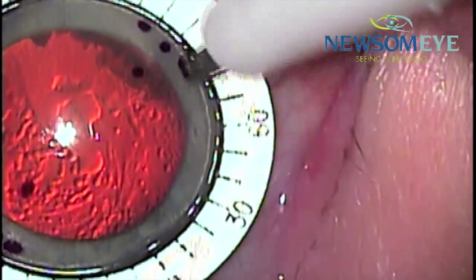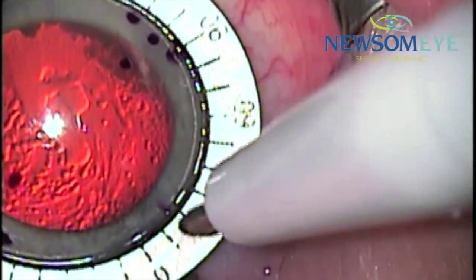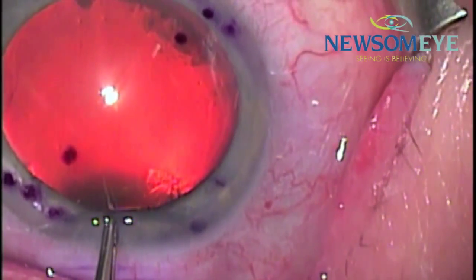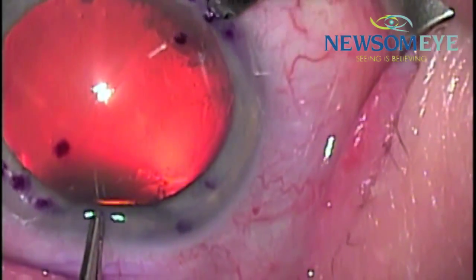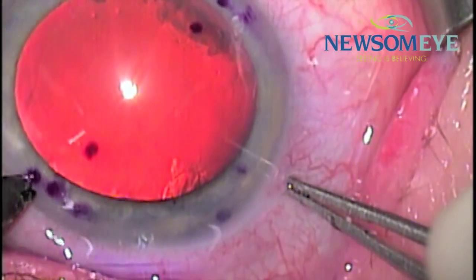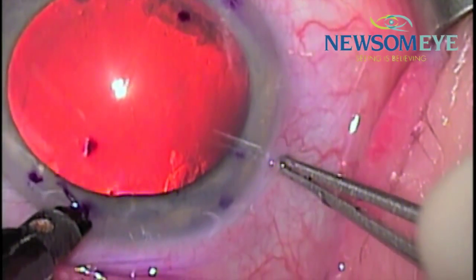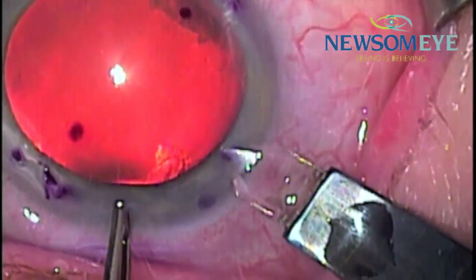This patient has more astigmatism than can be treated with just the star-toric intraocular lens. So we make some special incisions called limbal relaxing incisions — you can see one up above at the two o'clock position and one symmetrically matching down at the eight o'clock position.